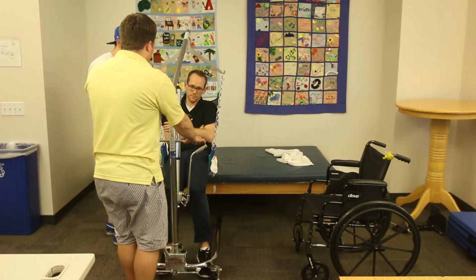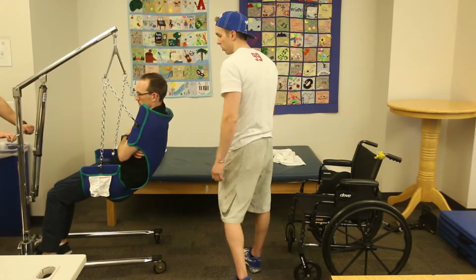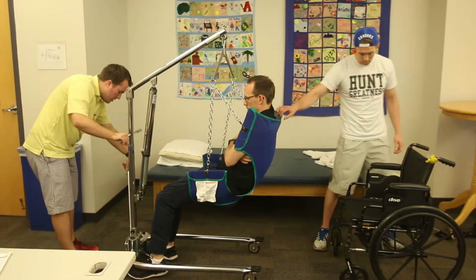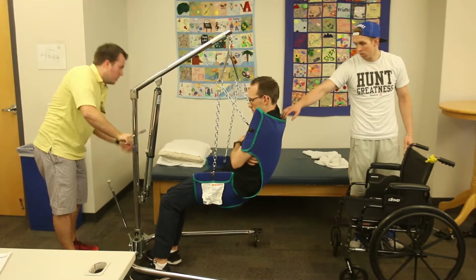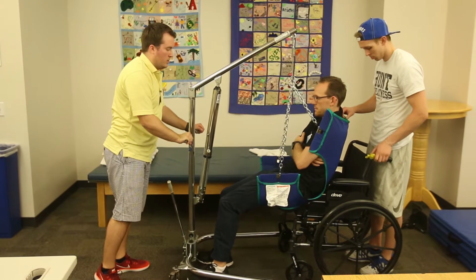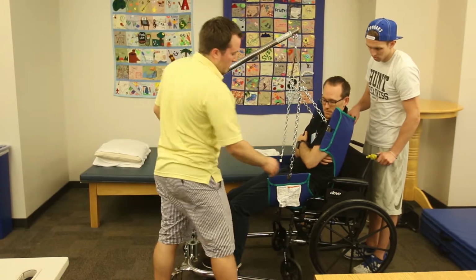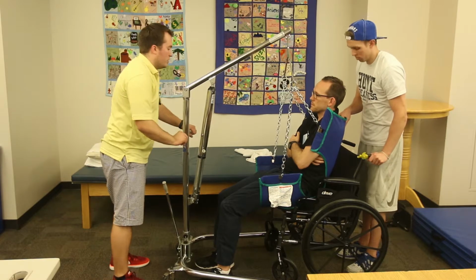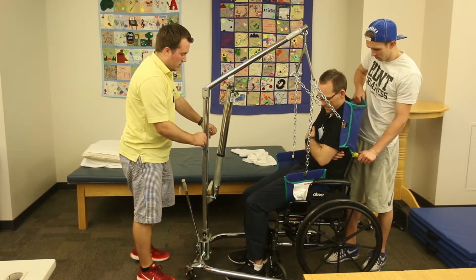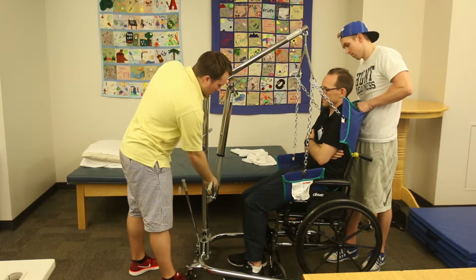Perfect. Now as we come around, we're gonna have Jared come behind you. We're gonna back into the wheelchair. He's gonna make sure that you're aligned and squared away. Let me adjust this. Perfect. So what Jared's gonna do, as I push you back into the wheelchair, is he's just gonna pull you back towards the back of that wheelchair. And yeah, just like that, he's gonna tilt it back. Make sure you get you as snug to the back of that wheelchair as possible. Bring you up a little bit more. Awesome. And then as I lower him, you're gonna lower him down carefully. Make sure to watch this. I'll watch it too to make sure the patient doesn't bump his head.